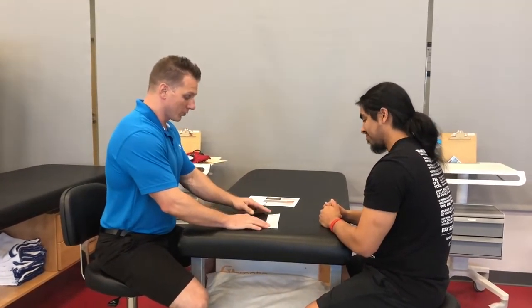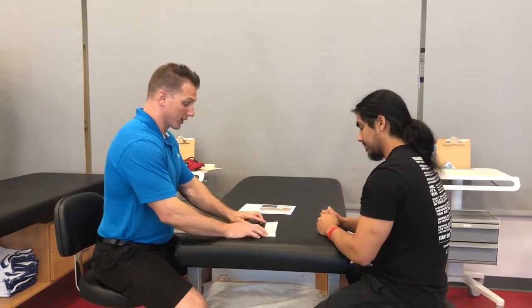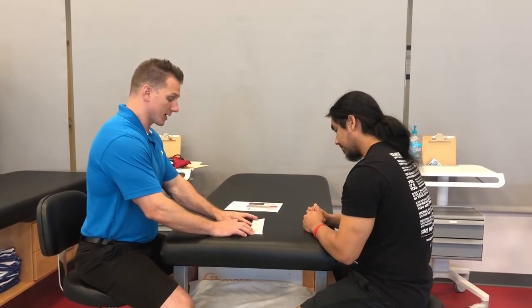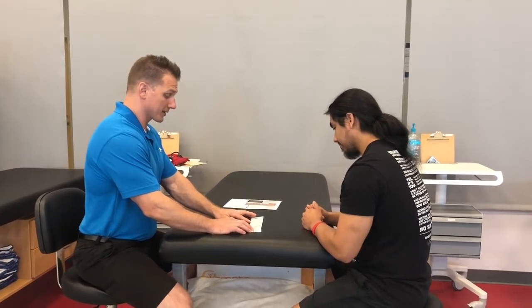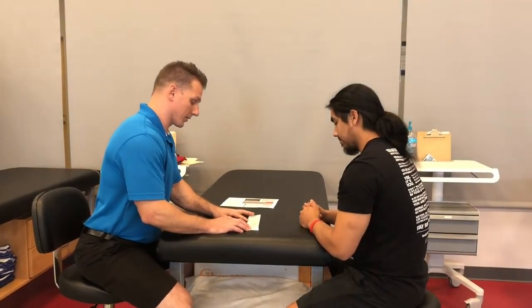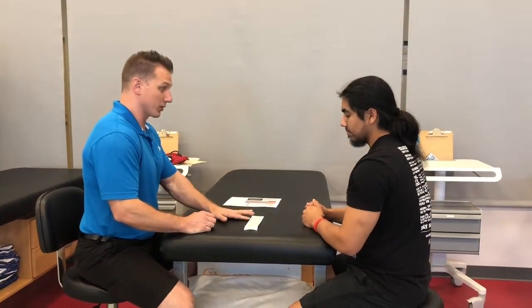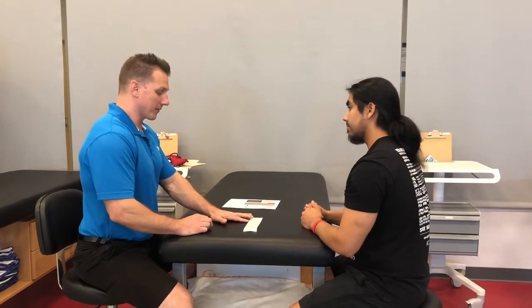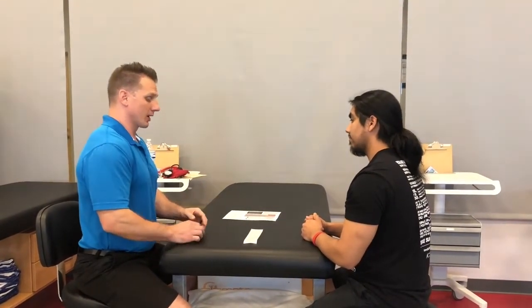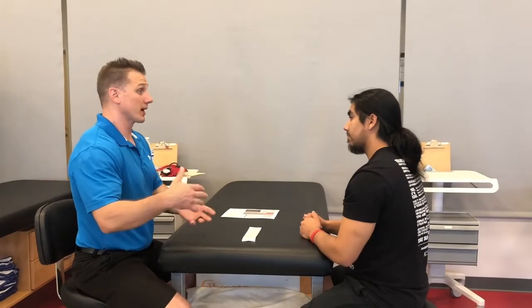Now looking at your readout, we see that it prints out your body type, your gender, your age, your height, the amount entered in for clothing, and then we get down to the actual results. We see your weight, recorded at 201.2 pounds. We have a fat percentage of 28%, and then we have a fat mass recorded as 56.4 pounds. Fat-free mass is listed as 144.8 pounds. So if we take your total weight of 201.2 pounds and multiply that by 28%, the fat mass shows that 56.4 of your 201.2 pounds is fat. Everything else — that's your fat-free mass: hair, nails, tissue, organs, fluid — that makes up the remaining amount of the poundage.